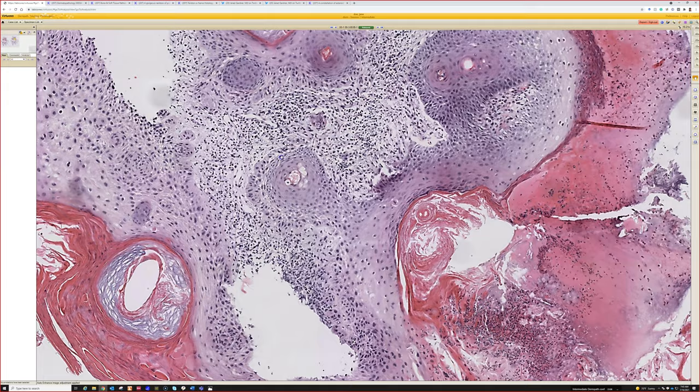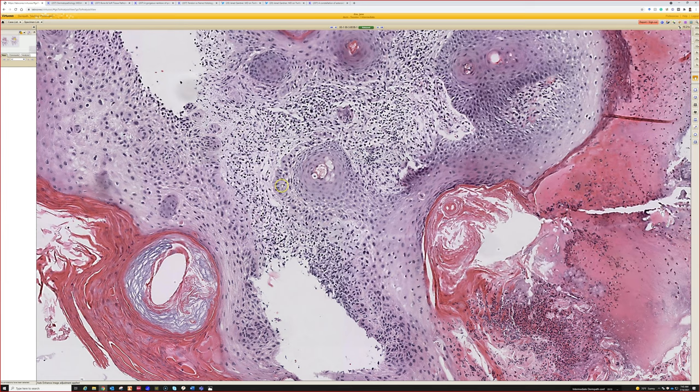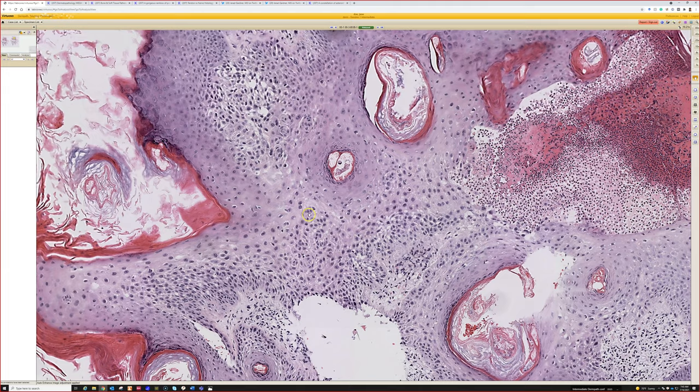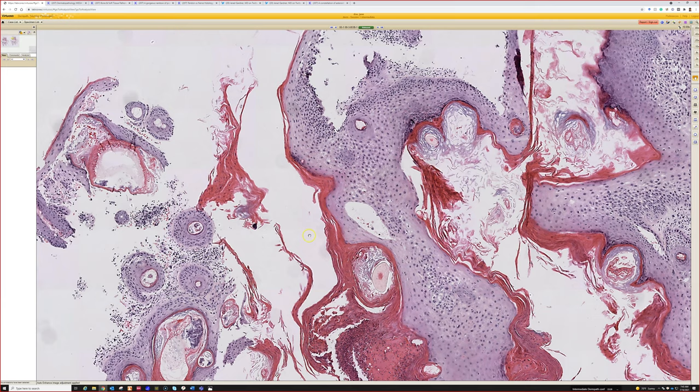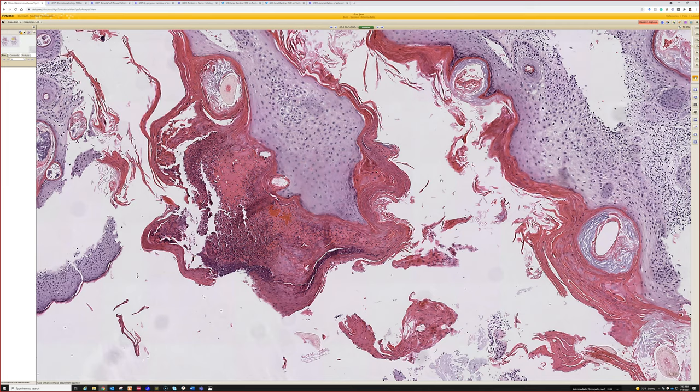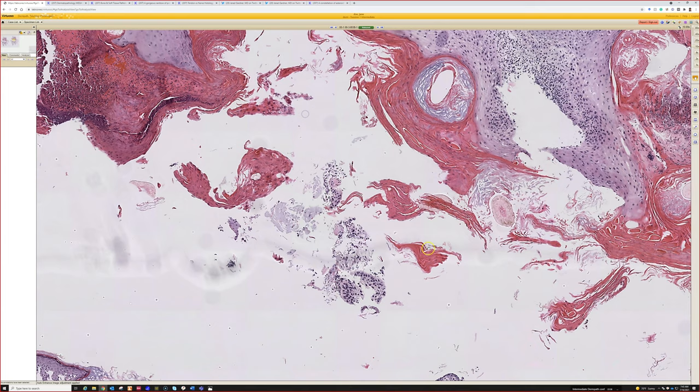On these, what I have to do is look at any place where I can see a relatively reasonable orientation. I see jumbled atypical basal keratinocytes going down to adnexal structures but seeming to mature at the top. So I'd say at least we have AK — actinic keratosis. I don't see any obvious full thickness, so maybe not obvious Bowen's or squamous cell carcinoma in situ. But what about invasive squame? Sometimes we have actinic keratosis on top and it jumps straight to invasive squame without becoming squamous cell carcinoma in situ first.